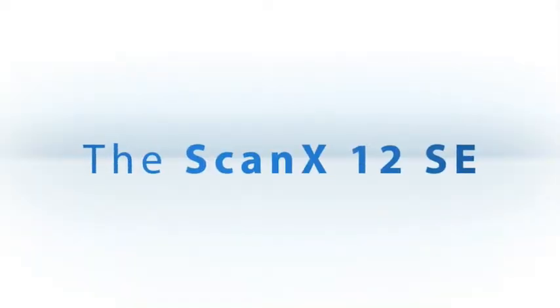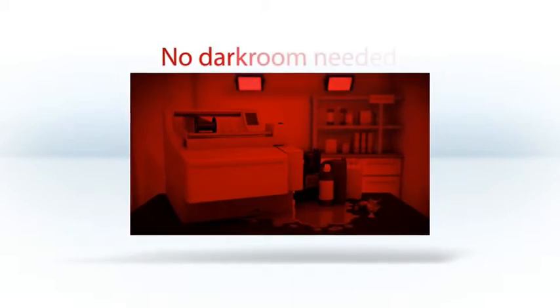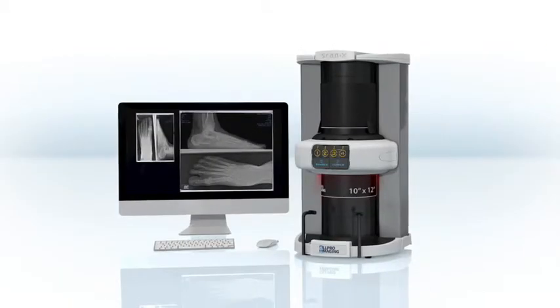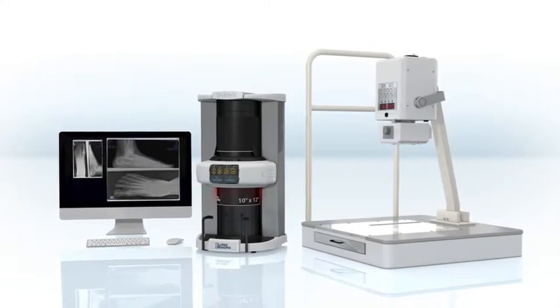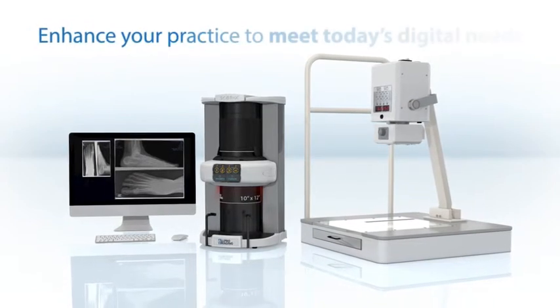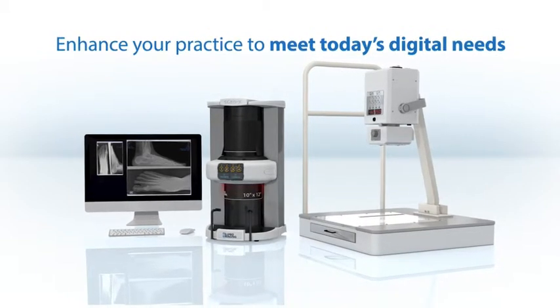The ScanX 12 SE can work within your facility in two ways. Enhance your existing X-ray source by replacing any chemical analog film processor and thereby eliminating the need for a darkroom. It can also be paired with a new X-ray source giving you digital images. Either of these flexible options will enhance your practice to meet today's digital needs at a more economic cost and efficiency than any other digital solution in the industry.